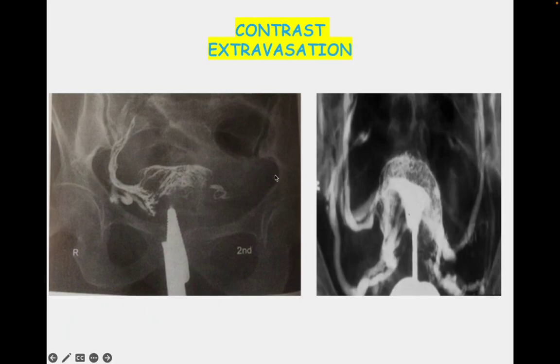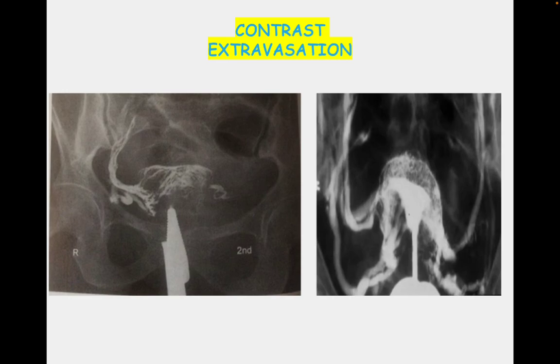The contrast extravasation shown here is because of blockage with dye getting into the vessels. So these were all the typical HSG findings in tuberculosis — the classic terms found in textbooks — and I hope they are now clear to you. Thank you.